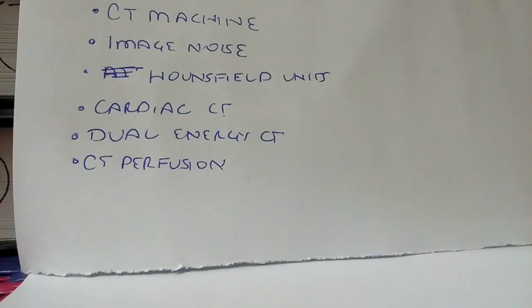prospective gating is done, in which the ECG is taken, and when the ECG shows the finish of the R peak, then that is the start of the diastole, and the cardiac scan is taken.